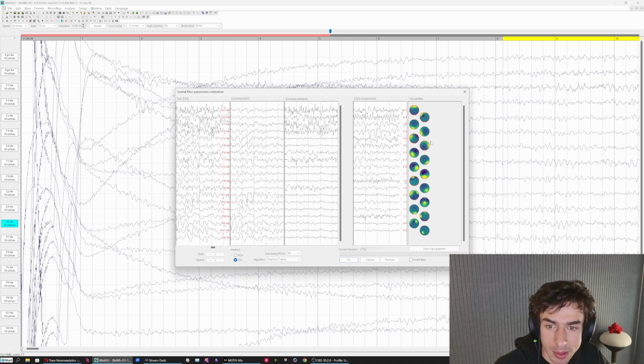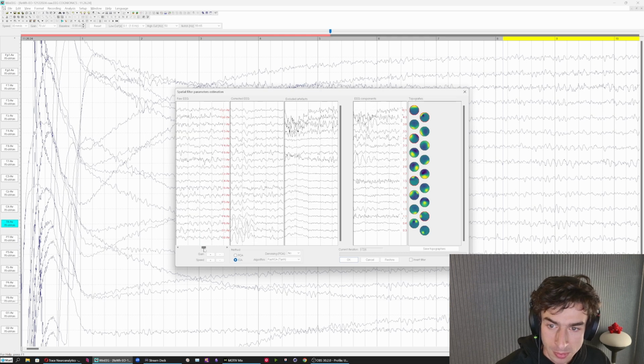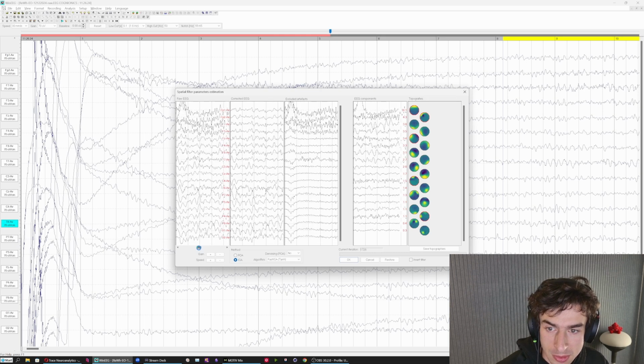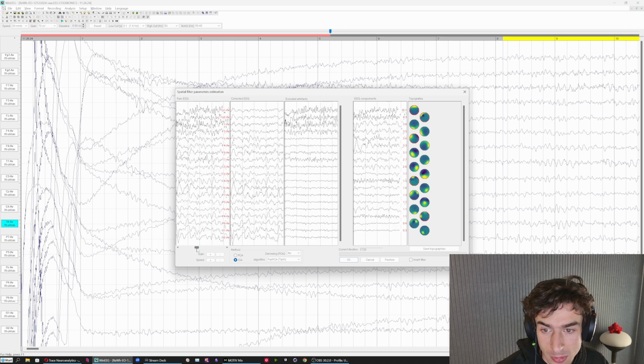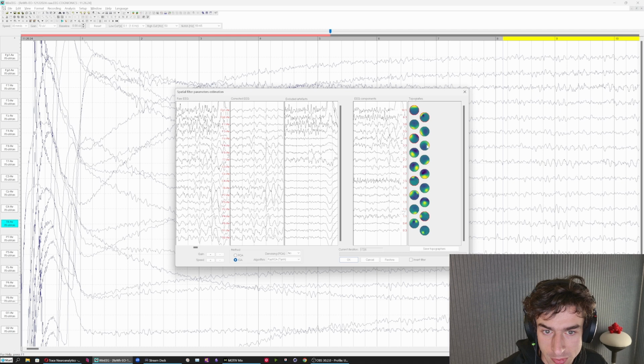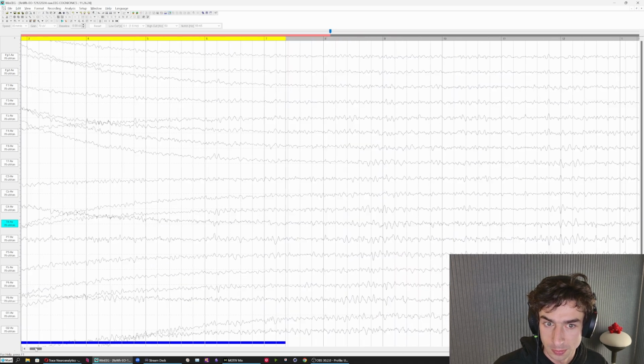So how badly do we want that EMG out versus how willing are we to ignore the excessive high frequency activity that it's going to show up in the spectra in honor of preserving the slower stuff that this would otherwise be squashing. I'm going to leave that unselected, and we're going to call this good enough for government work. We're going to manually clip that section out.